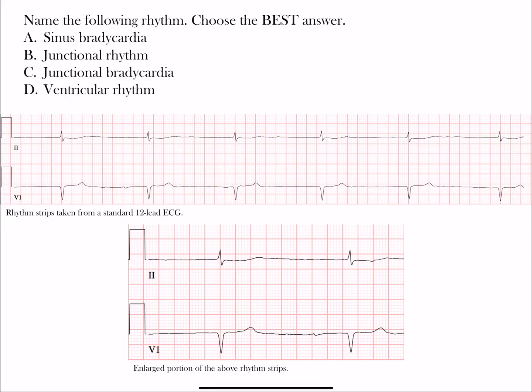Welcome back to another rhythm challenge. What you want to do is name the following rhythm, choosing the best answer. Our answer choices are: sinus bradycardia, junctional rhythm, junctional bradycardia, and ventricular rhythm. We have rhythm strips here from a standard 12-lead ECG — lead 2, an inferior limb lead, and lead V1, a right precordial lead. There's also an enlarged portion of those same rhythm strips to help you see the smaller boxes. Pause the video, take a few moments to choose an answer, then restart and we'll go through it together.